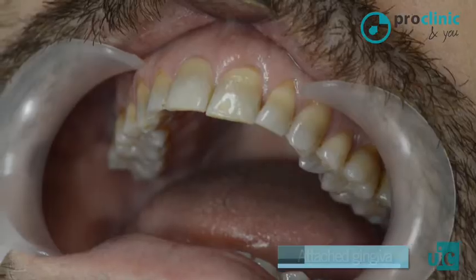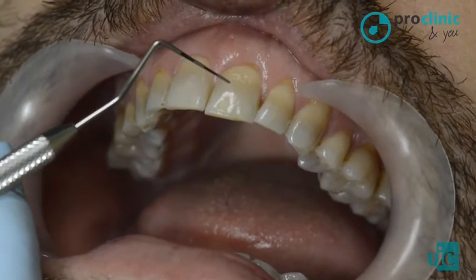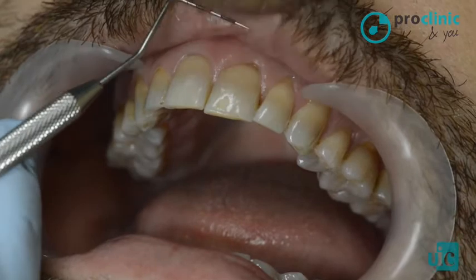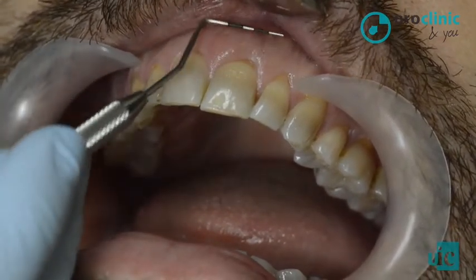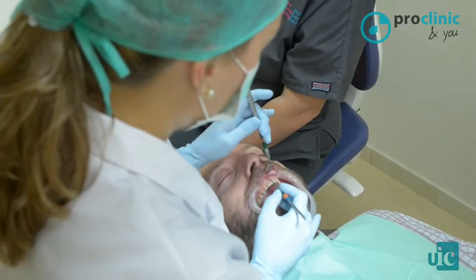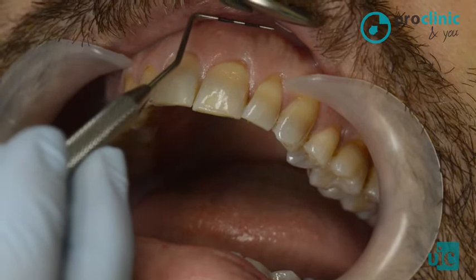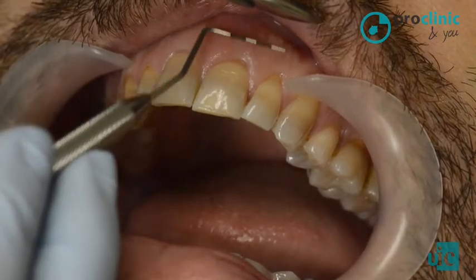Regarding the attached gingiva, we usually register on the periodontal chart values of 2 or less. In order to determine the attached gingiva of each tooth, firstly, we have to locate the mucogingival line. In those cases where it is difficult to assess the location of the mucogingival line, the periodontal probe should be placed perpendicular to the longitudinal axis of the tooth and make a crease.